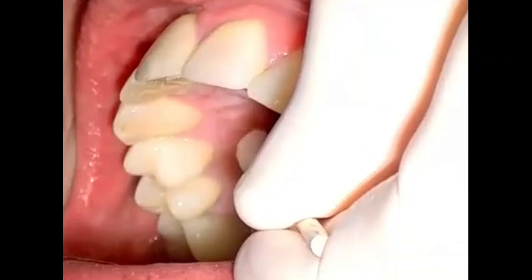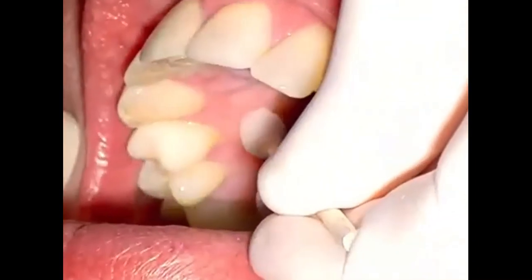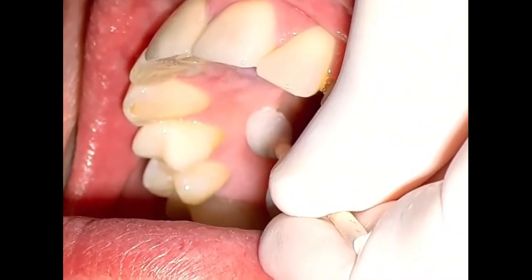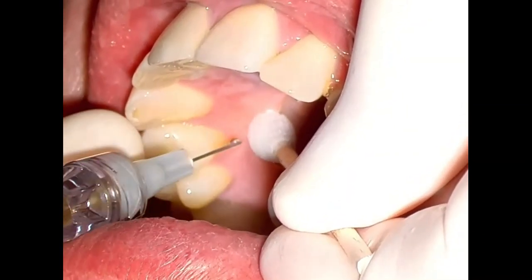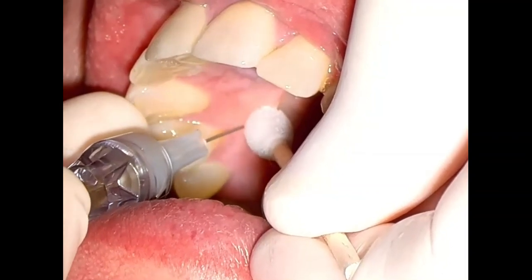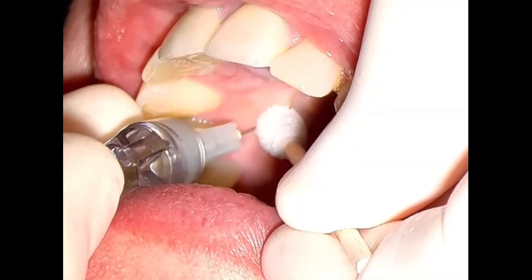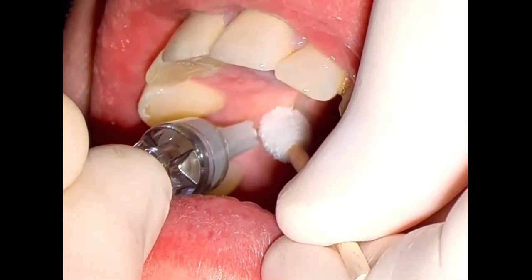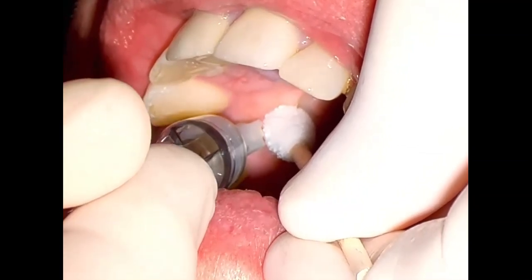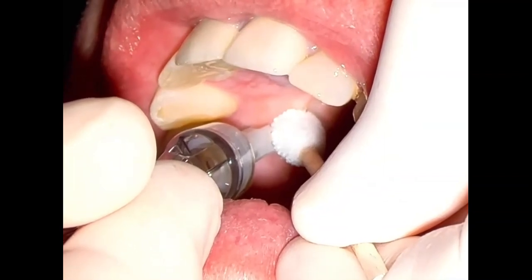For the maxillary palatal injection, I'll apply refrigerant spray, such as endo ice, to the palatal tissue prior to injecting. You can also use the end of a dental mirror handle if you prefer. If using a refrigerant spray, saturate the end of a Q-tip with the endo ice. I immediately place the Q-tip on the palatal tissue for 5 seconds. Then, while leaving the Q-tip in place, insert the needle and begin injecting very slowly. I inject a half a carpule of lidocaine 1 to 100,000 with epinephrine over the course of 1 minute.